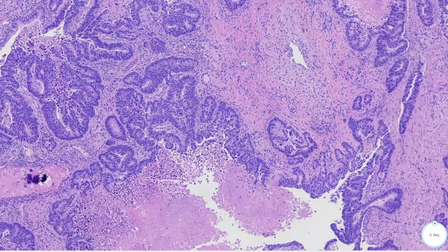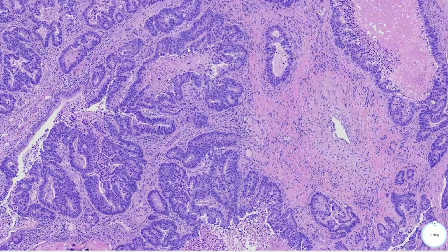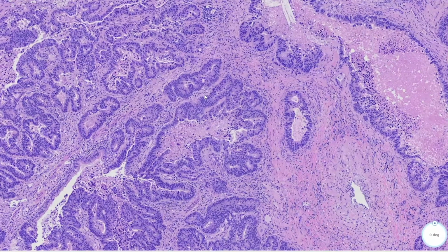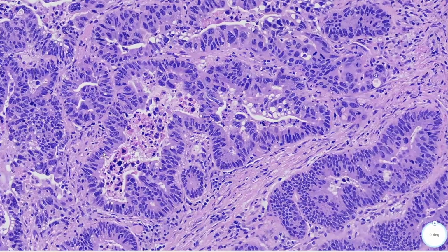And for an adenocarcinoma, it's important to think whether this is a primary tumor or a metastatic tumor. A lot of times the history can help you a great deal. So in this case, the patient had a history of a colorectal carcinoma, as well as bilateral lung masses. And this morphology is very classic for a metastatic colorectal cancer, with this columnar appearance of the cells and this luminal necrosis.